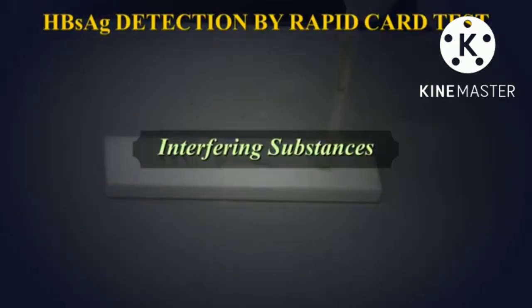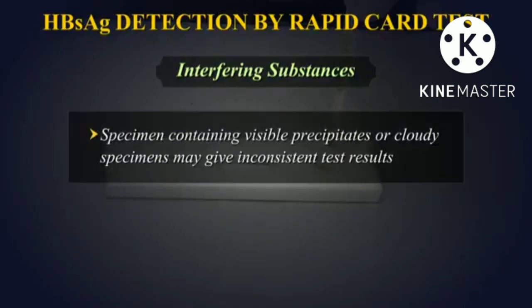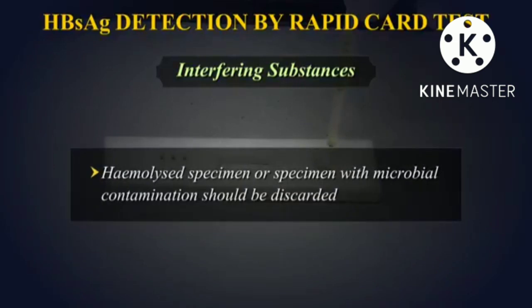Interfering substances. If testing within 3 days is not possible, specimen should be stored frozen at -20 degrees centigrade. Specimen containing visible precipitates or cloudy specimens may give inconsistent test results. Such specimens should be clarified prior to testing by high-speed centrifugation, that is 10,000 rpm, for 15 minutes before testing. Hemolyzed specimen or specimen with microbial contamination should be discarded and fresh aliquot should be collected.